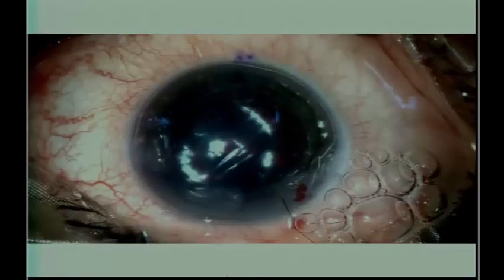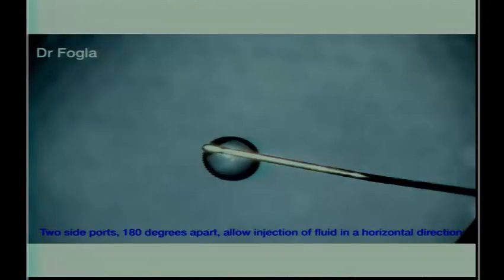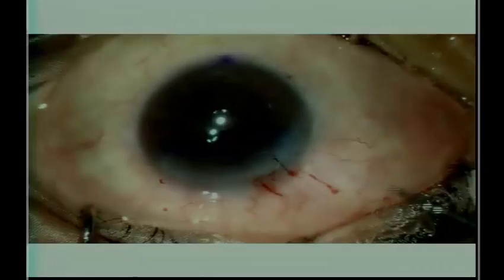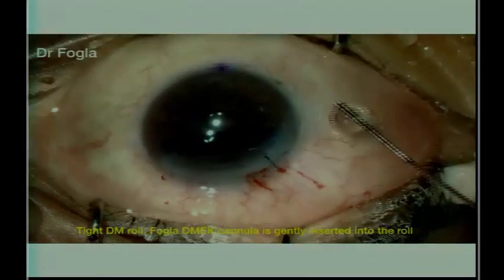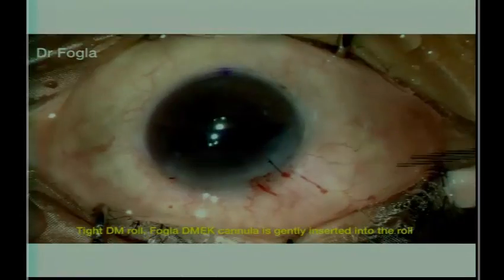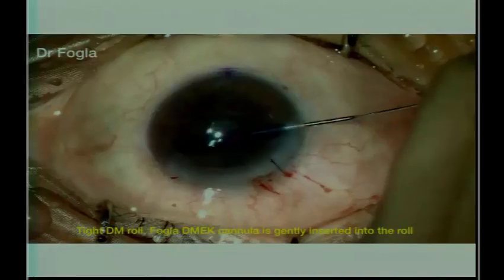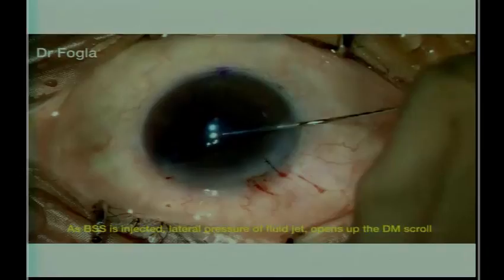Now that's the cannula that has the two side ports at the tip, and the fluid moves laterally. So I find that very useful, and I've ventured out to using donor tissue as young as 28 years old. I'm not worried about them getting into a tight roll because I have this device. So I align it to my paracentesis side, and I go with my cannula. I go inside the tight roll. That's the stromal surface. So once you're reaching the middle part, you give a short burst.